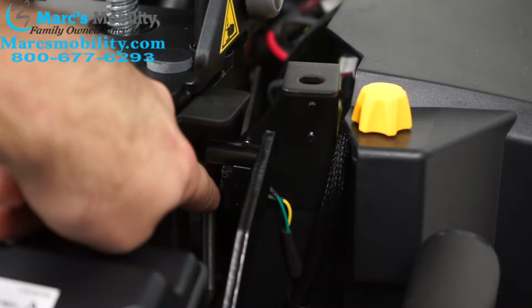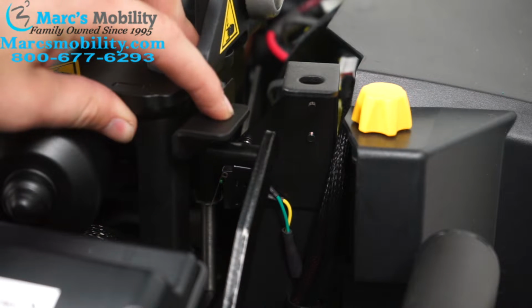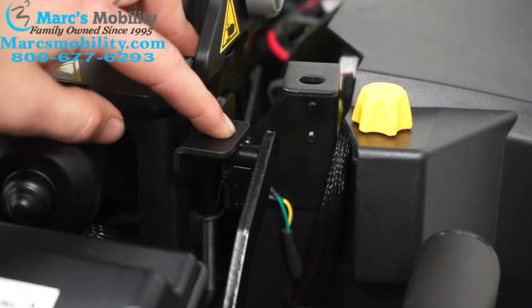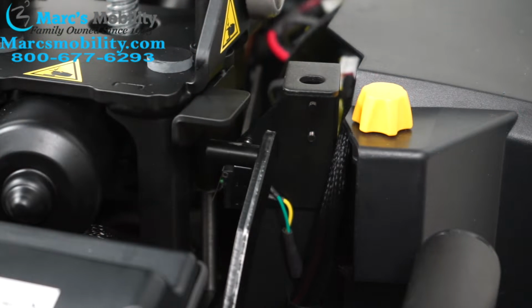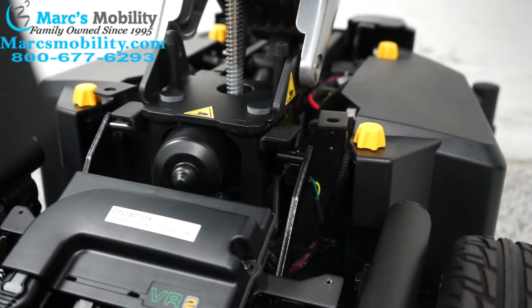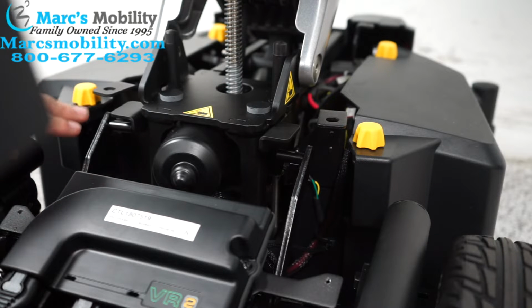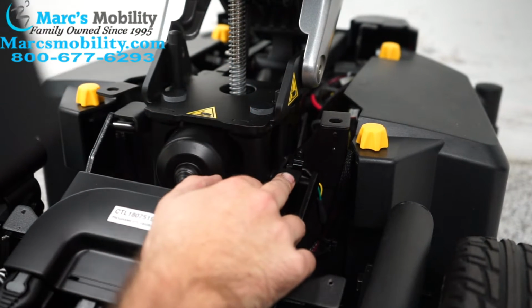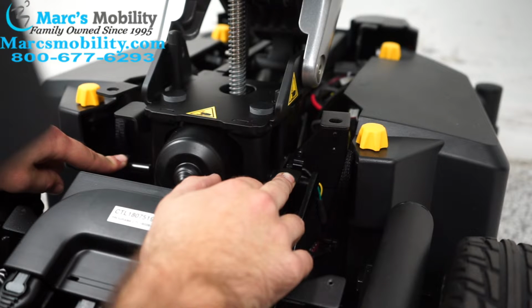You can hear the clicking. When the Air 2 seat goes down, it pushes down on this plate. And that plate will trigger that sensor, and it will prevent that level alarm from going off. So, for example, I'm going to back out the camera a bit. If I push this down, it triggers the alarm. Right? Now, if I push this down, and then push this down, this is what triggered the alarm earlier. Nothing happens.